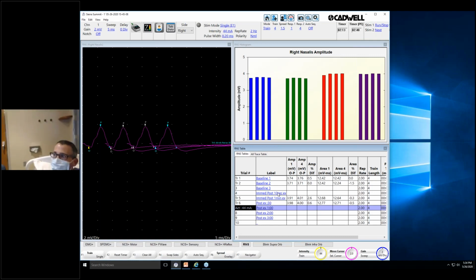You want to take that one? You're talking about, I'm going to come over so you can see. You mean muscle artifact? A stim artifact is what the question was. Sure. Let's bring that chair over so we both can get in. I think the question's relating to this here, right?